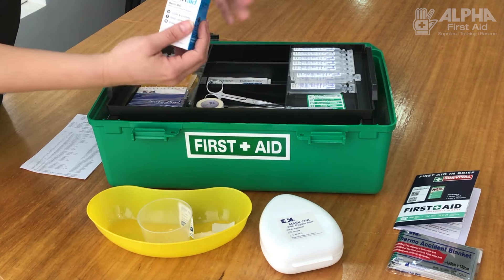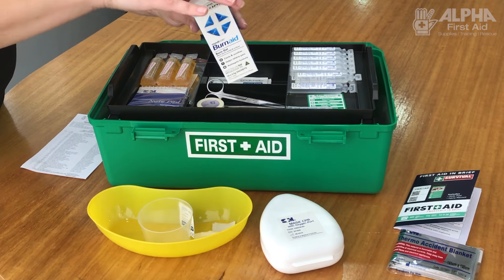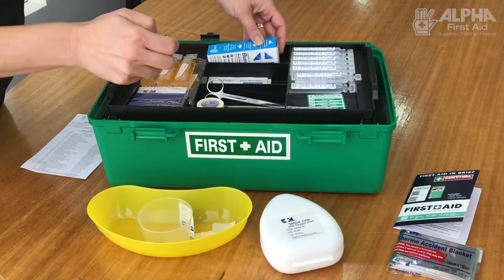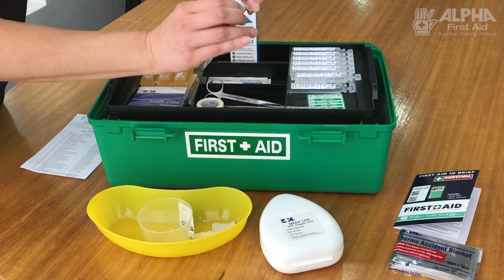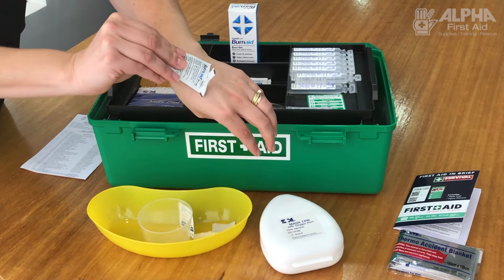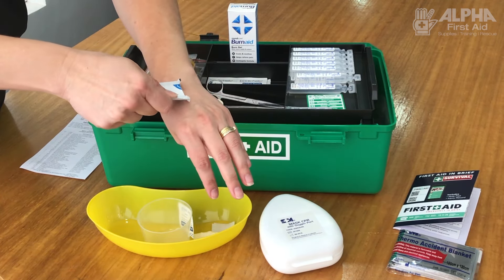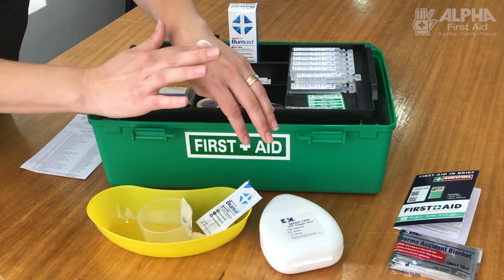On the top shelf of our first aid kit are the burn aid sachets. Burn aid is used if you've got a minor burn, and these little sachets carry about 3ml of burn aid gel. You just rip it open and put it on — it's a nice, thick, water-based lotion. It is not a cream and is specifically designed for burns. Make sure you put it on nice and thick.